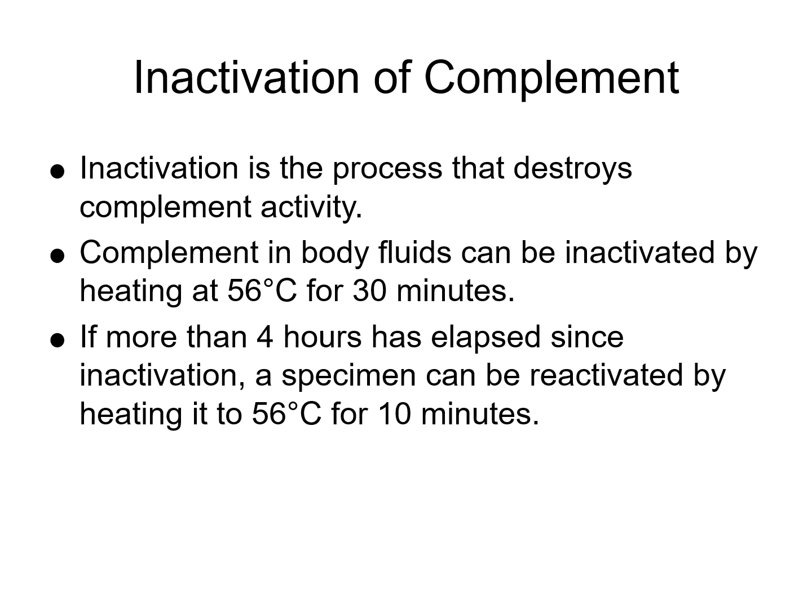So the inactivation procedure, we have a standard method. It's usually to heat the body fluid or the serum at 56 degrees Celsius for 30 minutes. This effectively destroys the complement activity while preserving the antibodies that we are going to test in the serology lab.